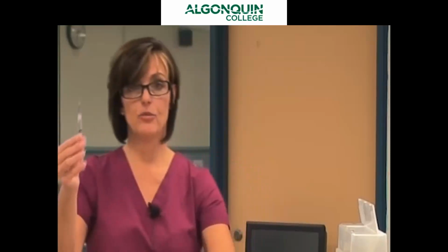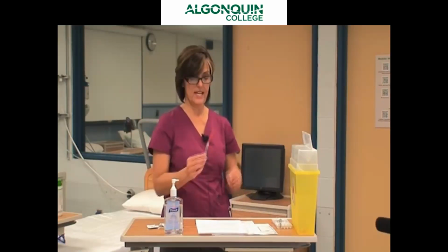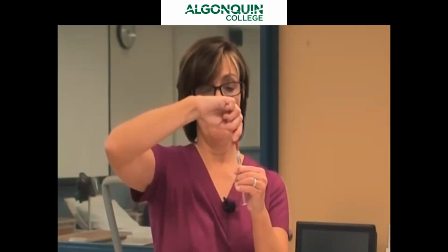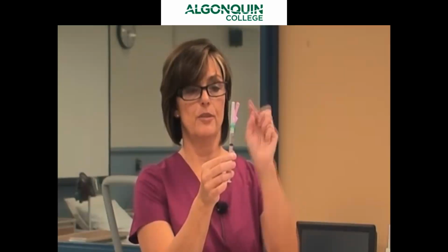Now I have to take this needle off and put on the needle that we're going to use to administer with. I don't want to recap that needle by putting my hand on it, so I use the table to recap this needle. I make sure it's clicked on, and then I remove it like this and put it in the sharps container. Then I'm going to secure my new needle that I'm going to inject with to the end.